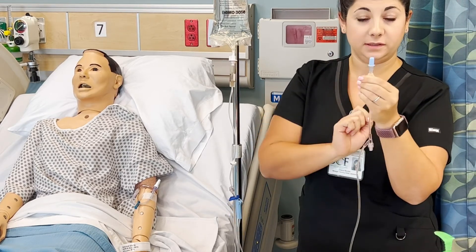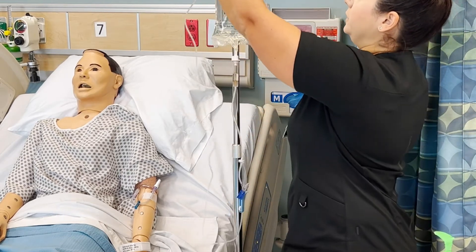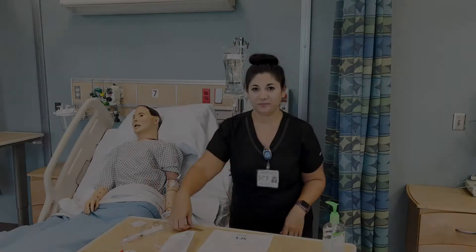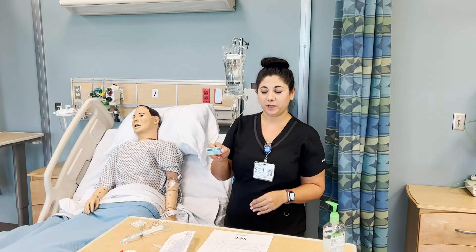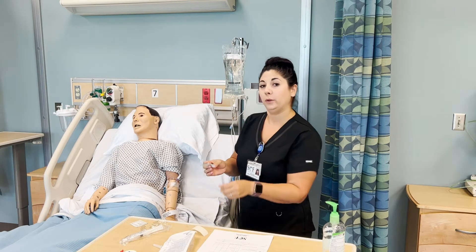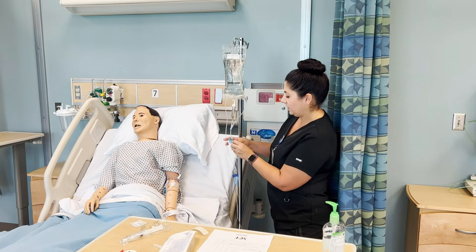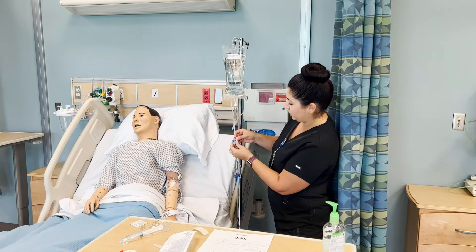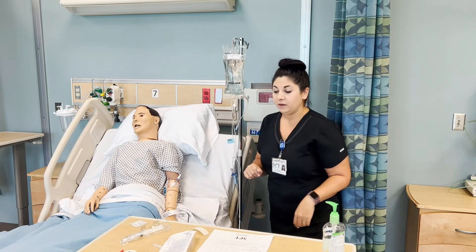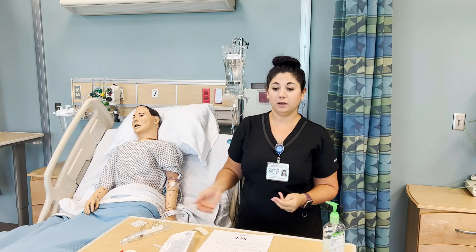Making sure this is closed so that we keep the sterility of that top. Now I'm going to drape this over and label my tubing. Check your hospital policy to determine how long your tubing is good for. These labels will tell you when to change the tubing — so this one says change Thursday. Now check your hospital policy to determine if you need to don gloves at this point.